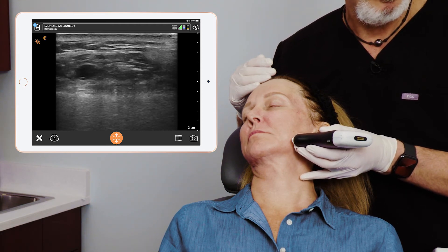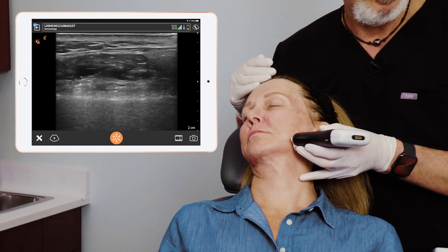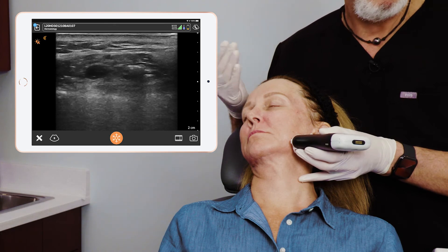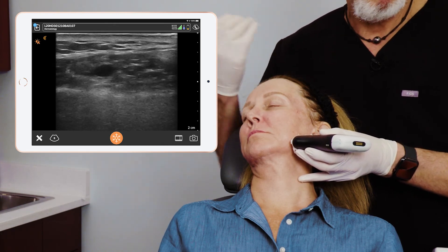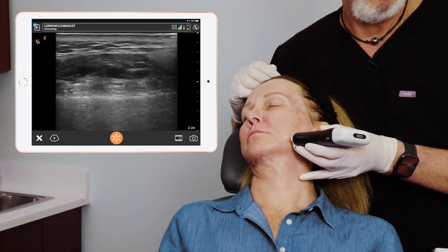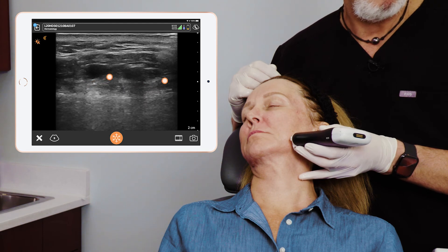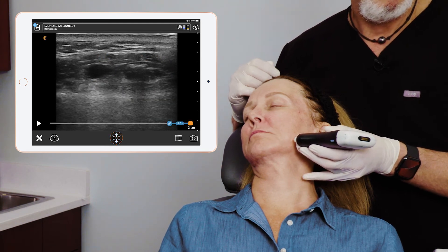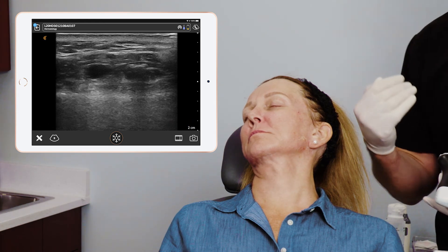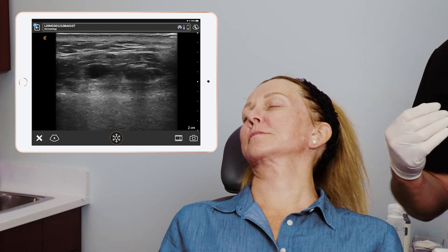You can tell it's HA because of that posterior enhancement - that's what HA looks like. Very anechoic, meaning black, and then posterior enhancement is white, behind it or deep to it. There are the two boluses right there next to each other. There's the two boluses, a little bit off of the periosteum, that posterior enhancement, and the anechoic HA product. Patient did great, hardly felt a thing.